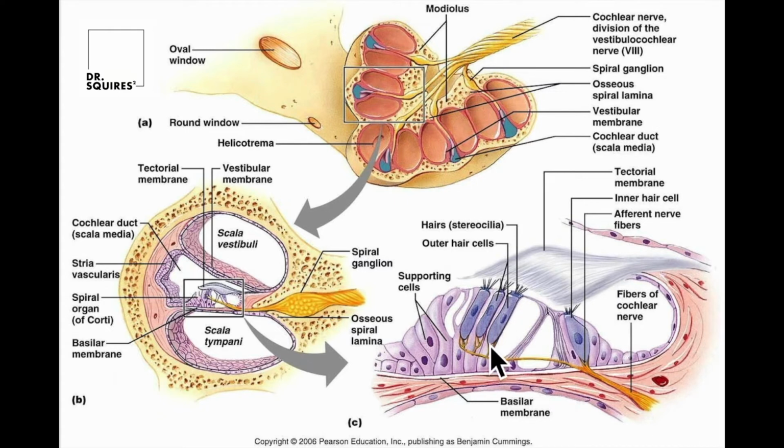So when these extend out, stretch, and then they contract back in, it sends a little teeny ripple back out the way that the sound wave came in, which will extend back out into the middle ear and then out into the ear canal where we will measure it.